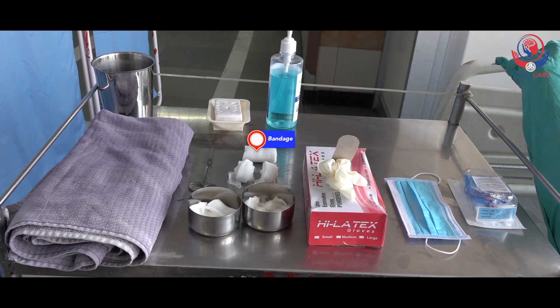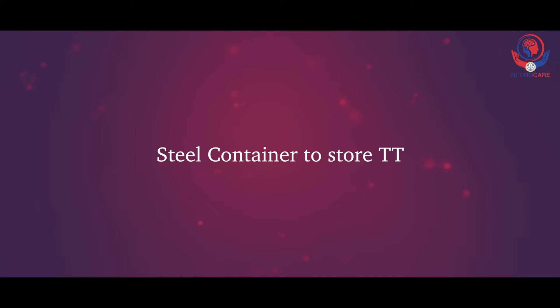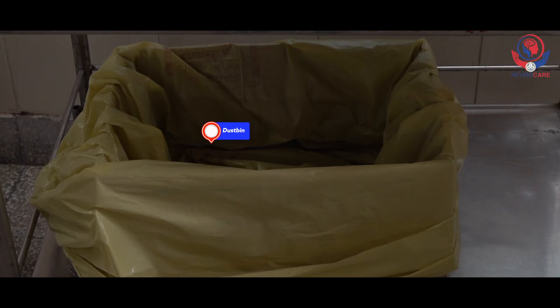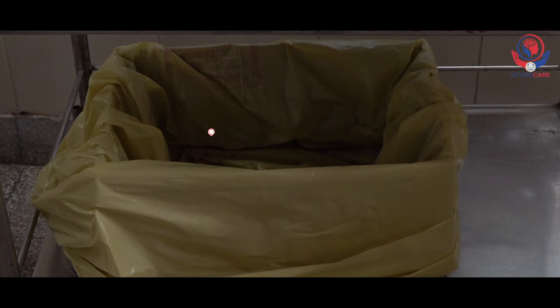A 4-inch bandage or ties approximately double the circumference of the patient's neck, to tie the tracheostomy tube around the neck. A steel container to store the tracheostomy tube, a pair of scissors to cut the bandage or ties, a small dustbin to collect waste materials, and hand rub and soap for washing hands.